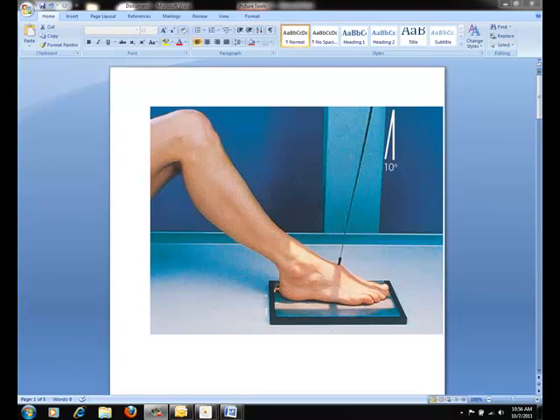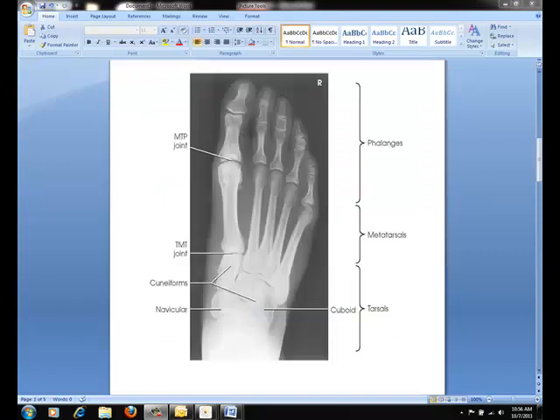Collimation should have 1 inch on each side, and be sure to include light field beyond the calcaneus and the distal tip of the toes. Once an exposure is made, the following image should be presented. Here there is evidence of proper collimation.